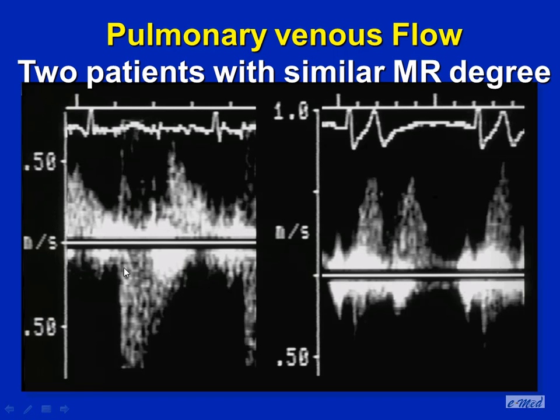If you have systolic reversal, it's mentioned as a good sign of severe mitral regurgitation. Now, this is an old slide, but I had these two patients in my echo morning on the same day. Both of them, we quantified the MR, and they had 65 cc's of regurgitant volume. One, this guy, has a large reversal of flow in systole in the pulmonary vein.